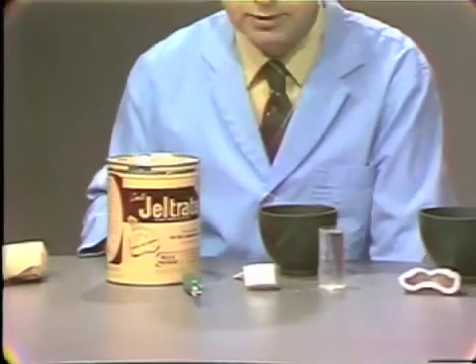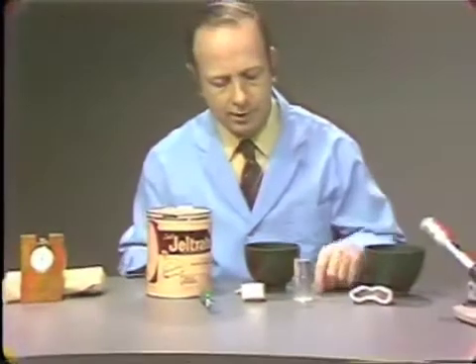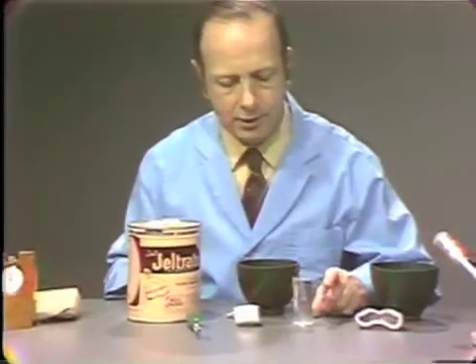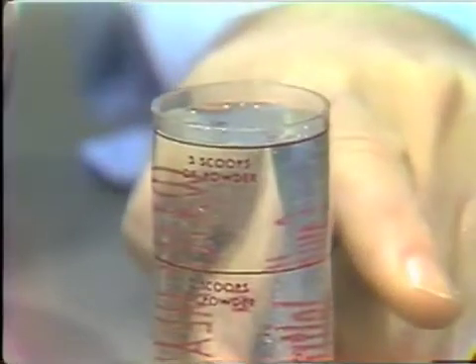Before we make the dispensing with powder, however, you should dispense the water. The manufacturer supplies a little cup with three marks on it. The water level for this particular mix will be for a full mouth impression, so we will use three scoops of powder and three divisions of water — one, two, and three.